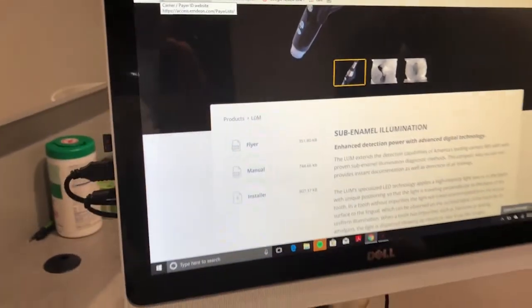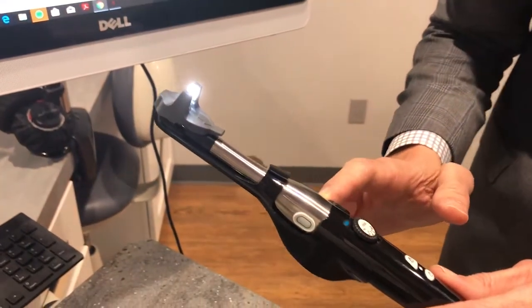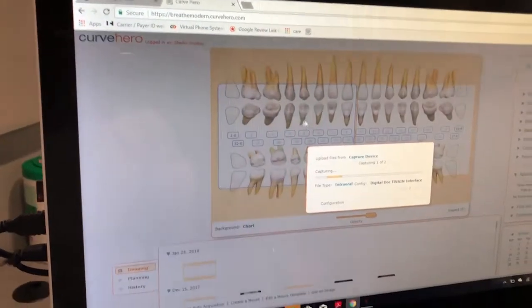Simply use the button on your Iris 2.0 camera to capture the image. I'll show you what it looks like when you see decay in a tooth.